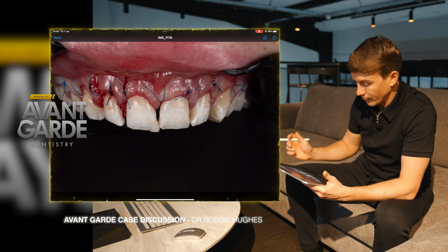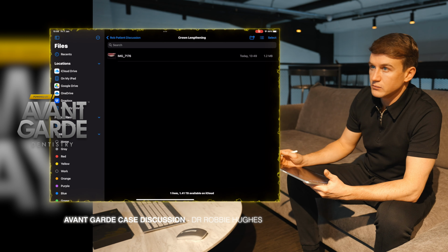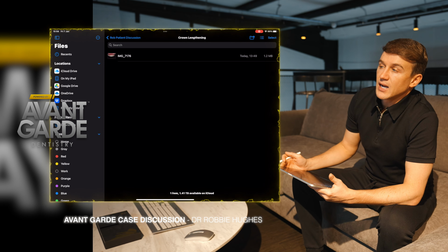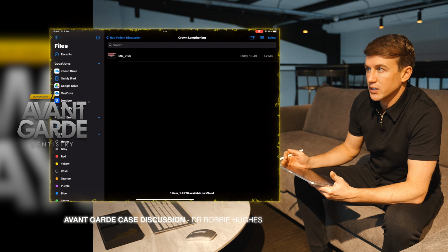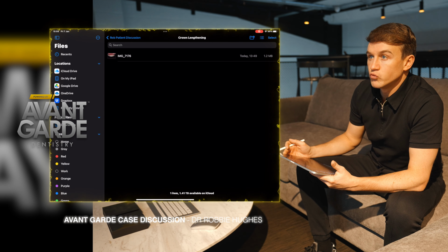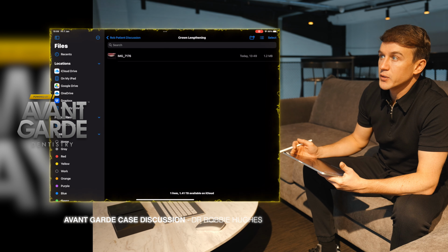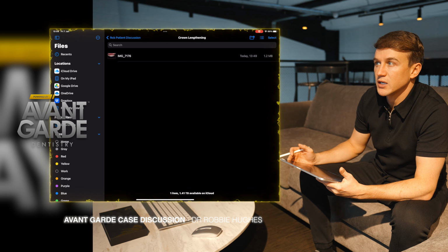We then leave that for 2 weeks and we remove the sutures, and we need to give it a total of 8 weeks healing time after the crown lengthening before we can execute the injection mold technique for the digital composite veneers. On a 2-week review, we will rescan the mouth with the intraoral scan to record the new gingival position, and then the lab can create what's called a final design mock-up for the injection mold technique.